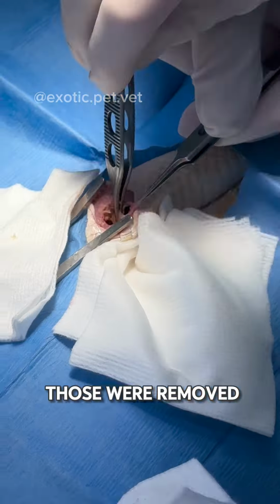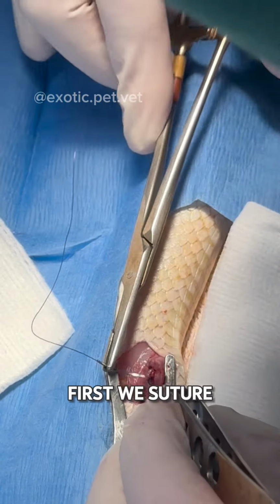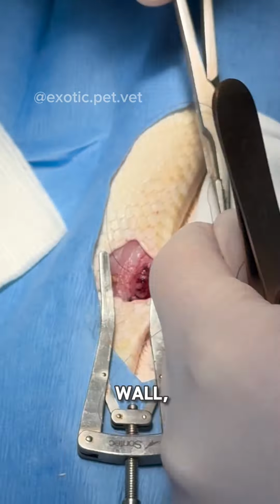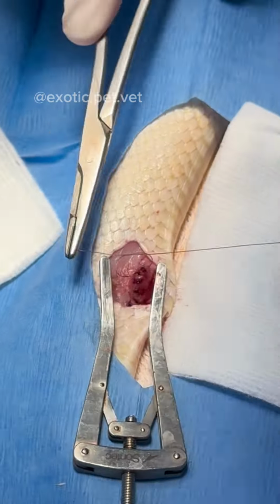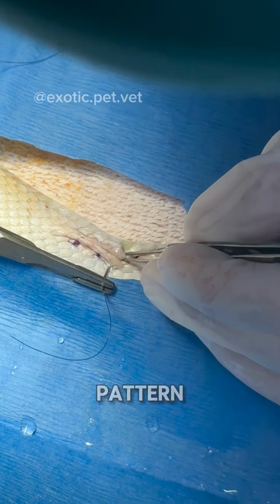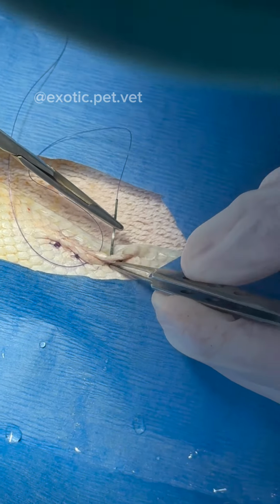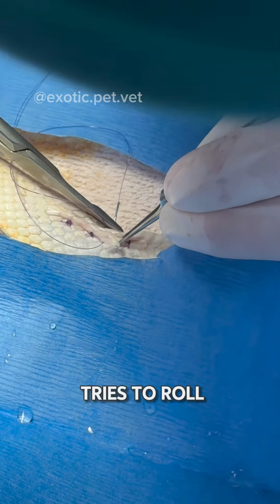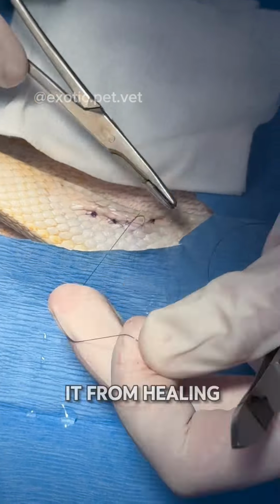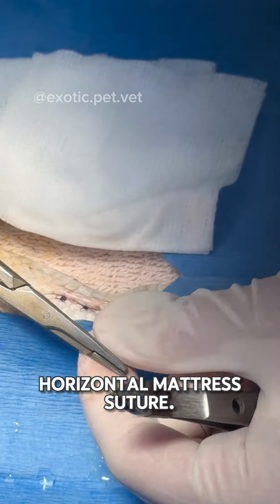Once all of those were removed and she was flushed out real good with sterile saline, it was time to suture her closed. First we sutured the oviduct, then the body wall, and lastly, the skin. One really important thing to know about suturing reptile skin is that you have to do an everting pattern, or a pattern that sort of rolls the skin outward where it meets. Due to the scales, the skin normally tries to roll in on itself, which can prevent it from healing appropriately. In this case, I use a horizontal mattress suture.